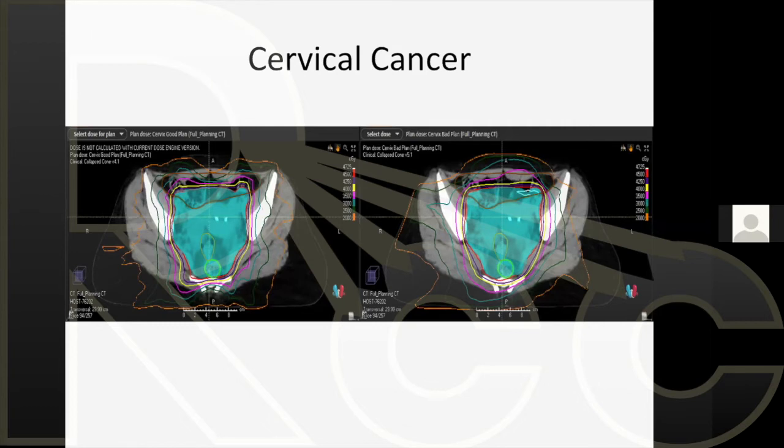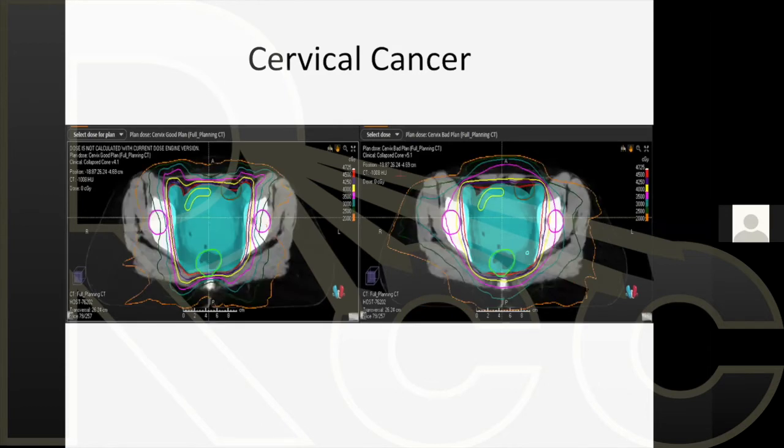But I think it has to do with, you have to look and see, what do we want to worry about and what is important to us? As we go further down, again, this is now treating more soft tissue anteriorly. So what's going to happen? Anteriorly, then the patient's going to have skin reaction.